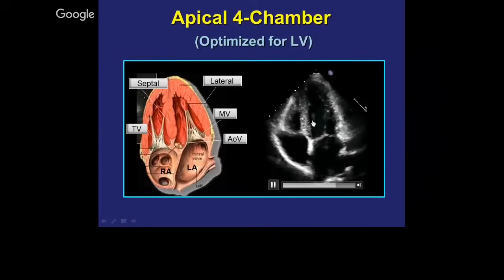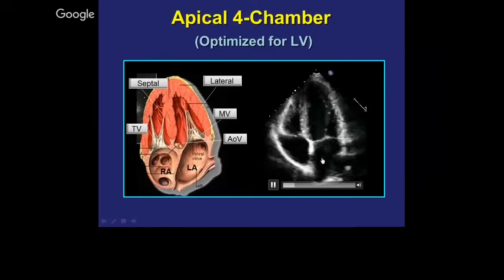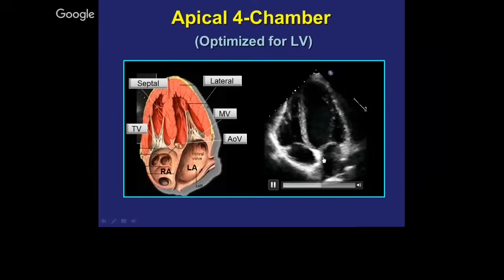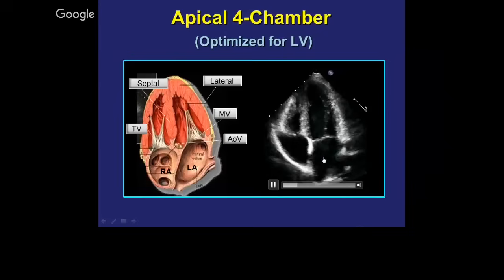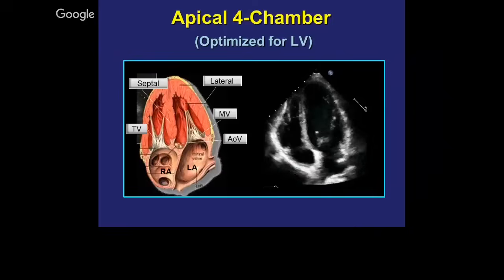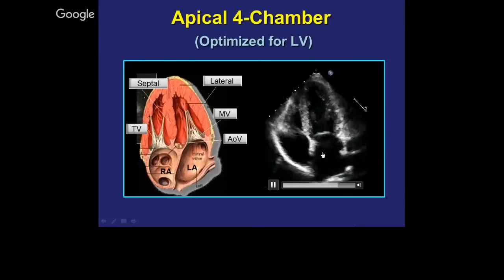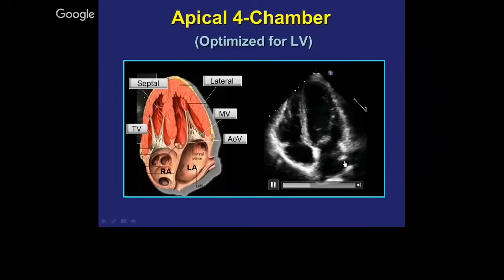When we move the transducer to the apex, we can see the apical view — this is what we call the four-chamber view, because you see all four chambers. You see the left and right ventricle and the right atrium and left atrium. The labels to the left show you what we're looking at: this is the septum, this is the lateral wall, this is the mitral and tricuspid valve, and this is the left atrium.